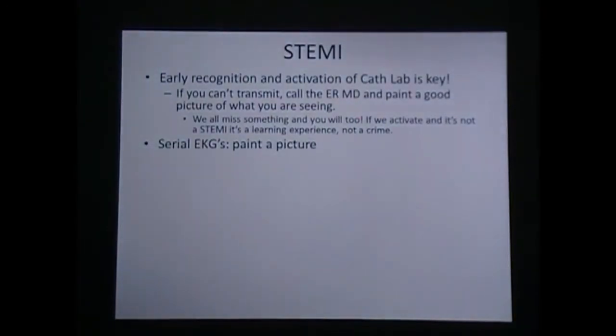Serial EKGs paint a picture, like I've talked about earlier. Make sure that you are getting serials when time permits, because that's going to allow us to see, and it actually shortens our decision-making process. If we see serials and things change, and I was talking to the captain, even if you do an intervention like, oh, I'm pain-free, get an EKG. So you can see, hey, look, nitro and morphine did this and we got these changes. Boom, that's huge because it helps us with how stable they are, how soon we need to intervene, do we need to go now, do we need to let them cool off a little bit. There's a lot of different things. So the serial EKGs are important.